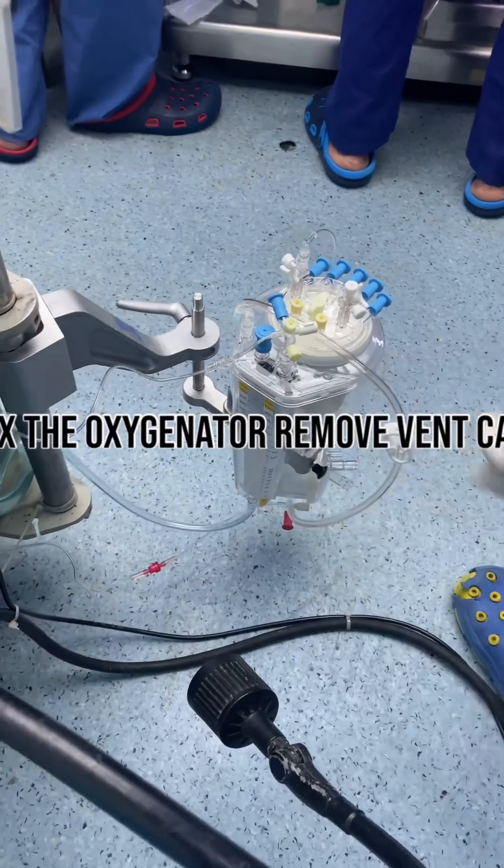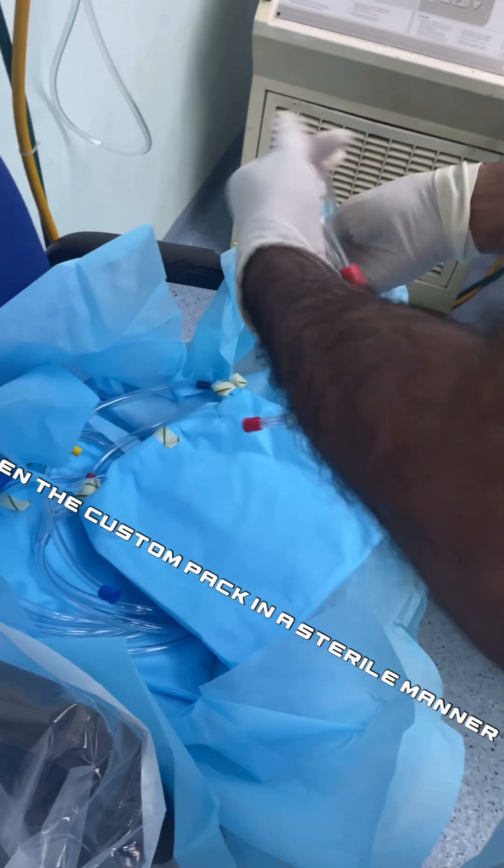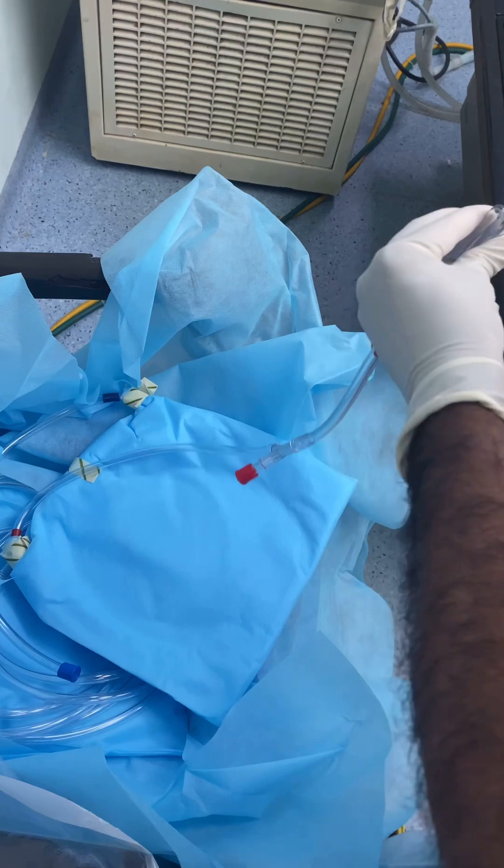Fix the oxygenator and remove the vent cap. Open the custom pack in a sterile manner. Cut the tubings to reduce hemo-dilution in neonates.